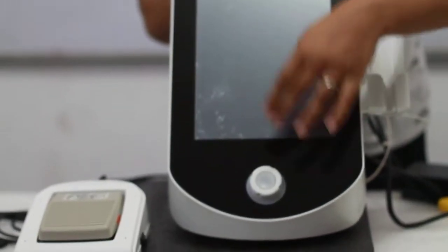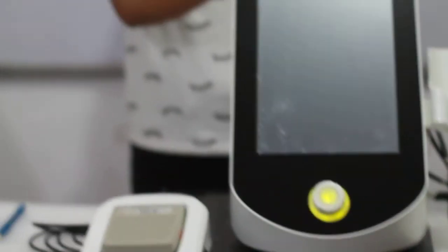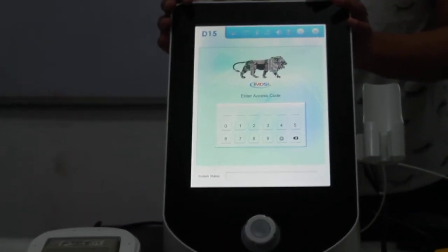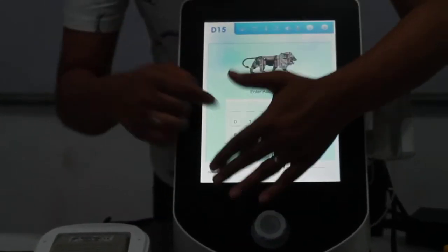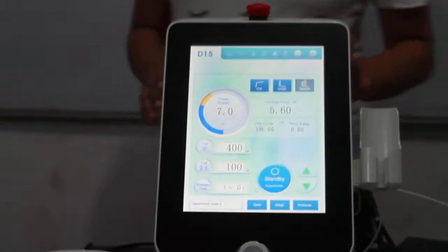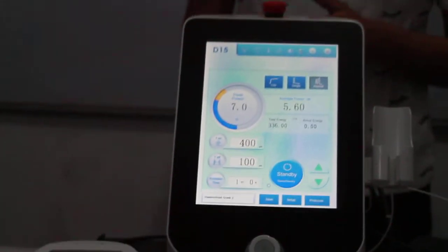Once it is connected, you have to put on your machine from the back side. There is an on and off button. Once you put on this machine, this will ask for your customized password. The password is provided by the machine.